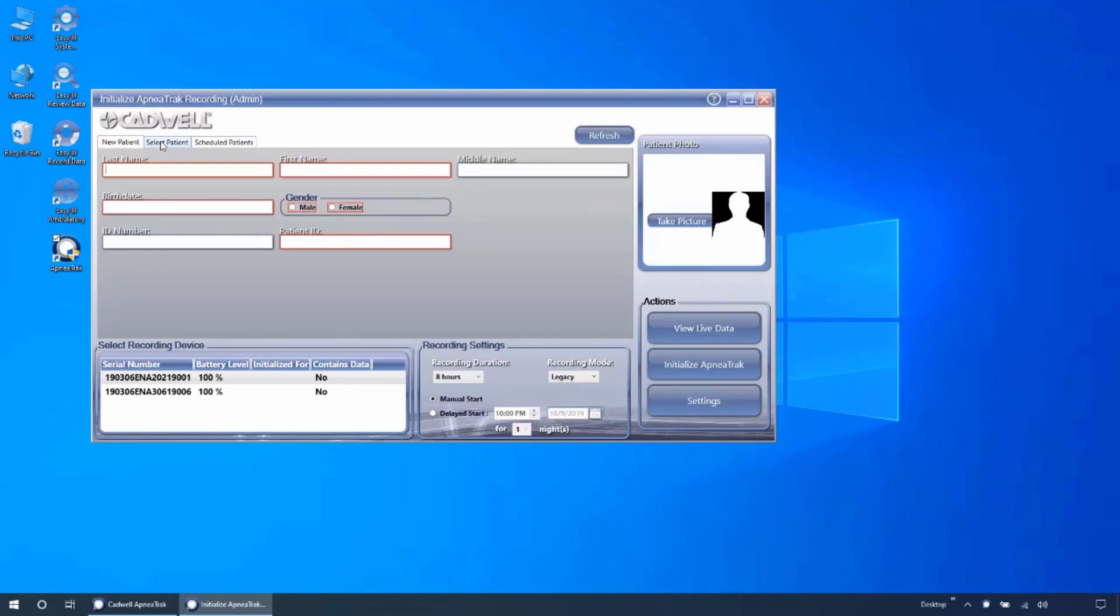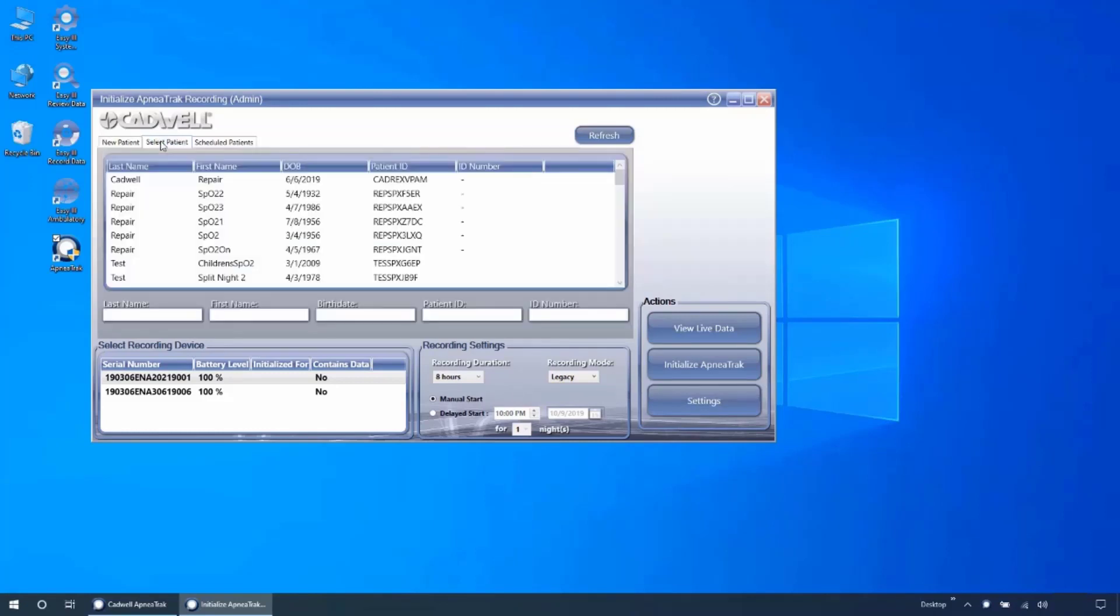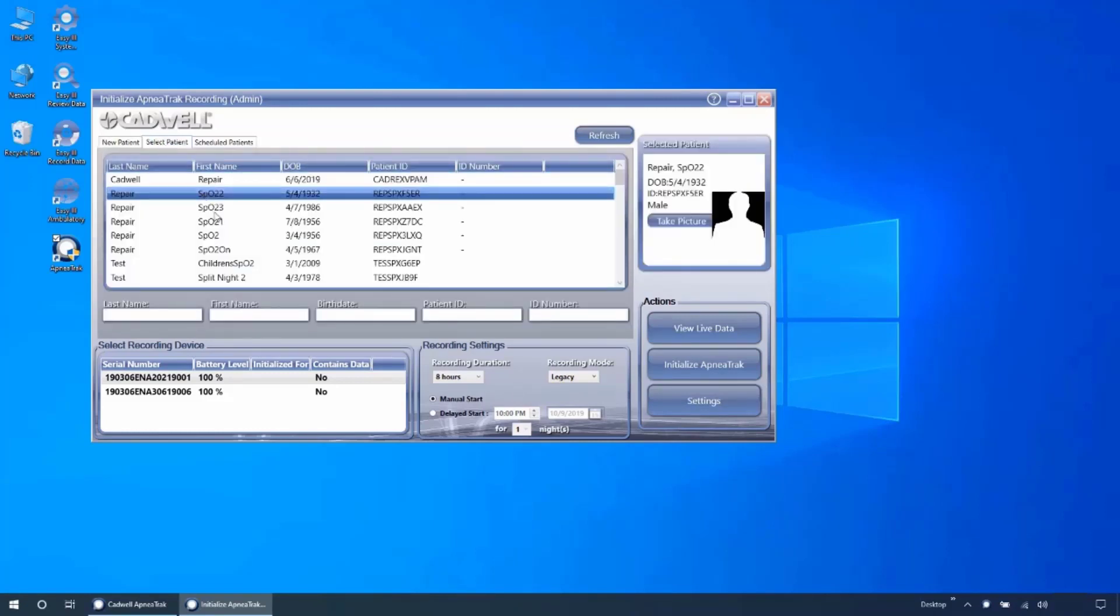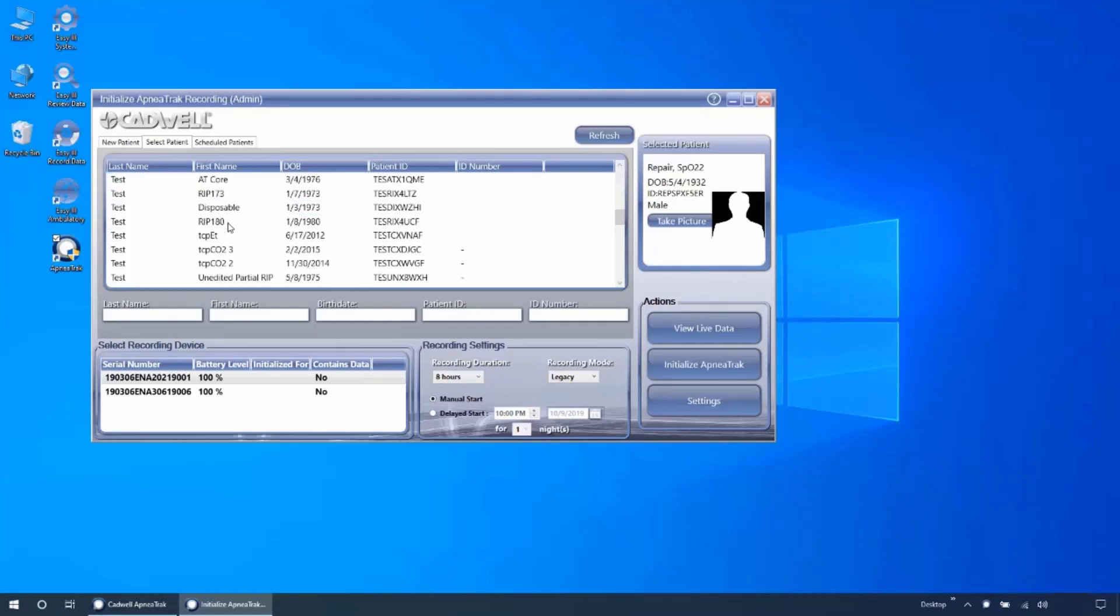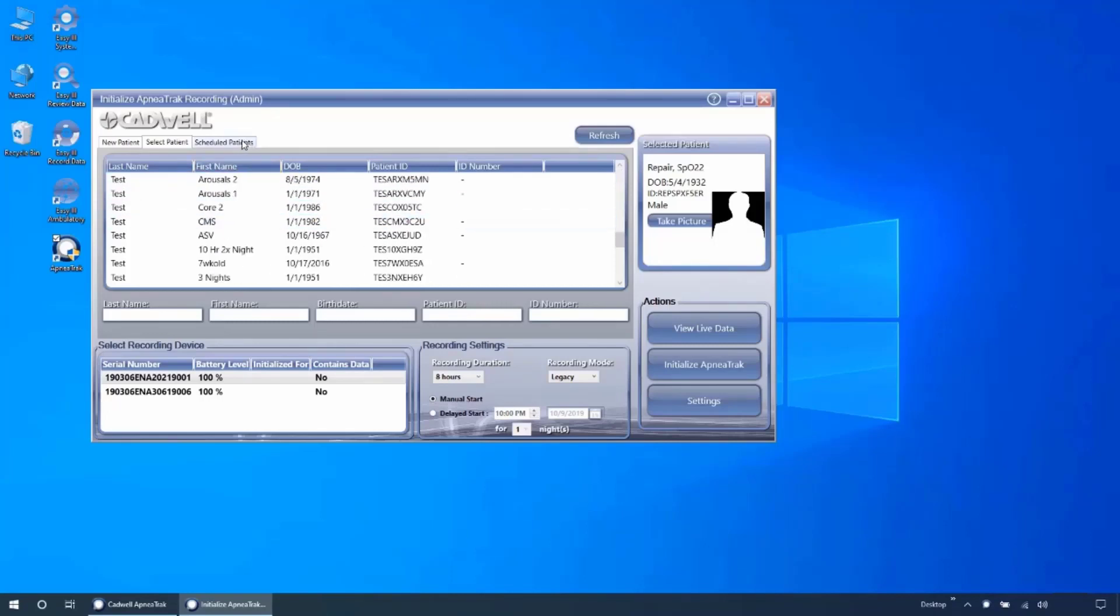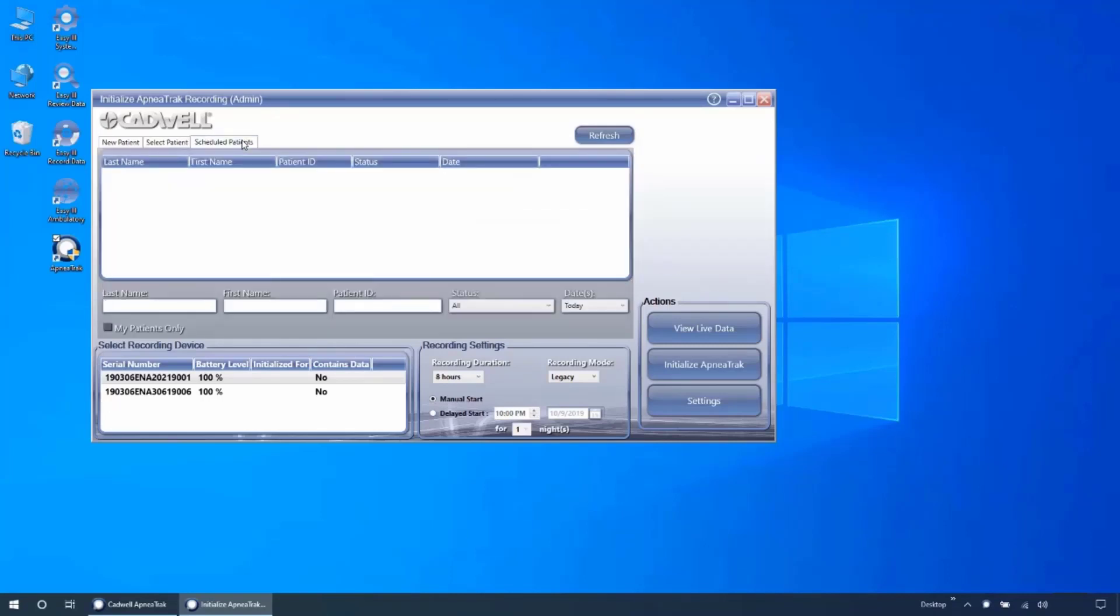Required fields are highlighted in red. The select patient tab allows you to select a patient that is already in your EZ3 database. The scheduled patients tab will allow you to select a patient from an order sent to your EZ3 application via HL7 or the EZ3 scheduler.